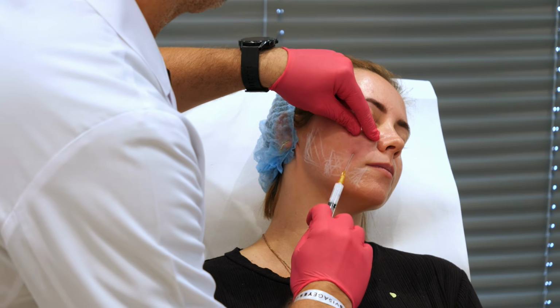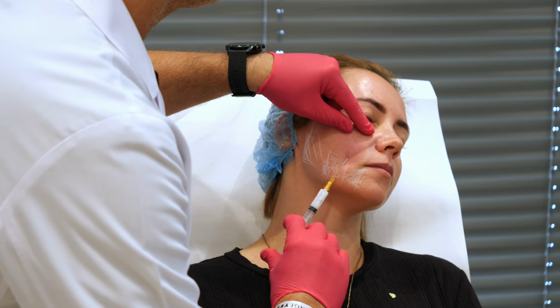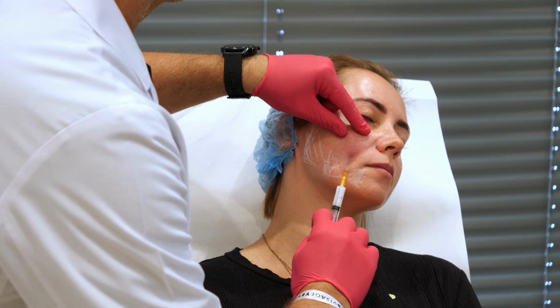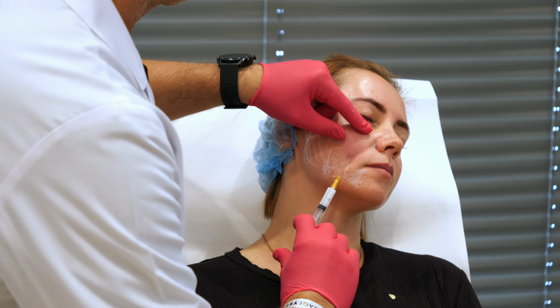With the other hand, the hand that helps us, not to trespass the retaining ligament of the orbital.